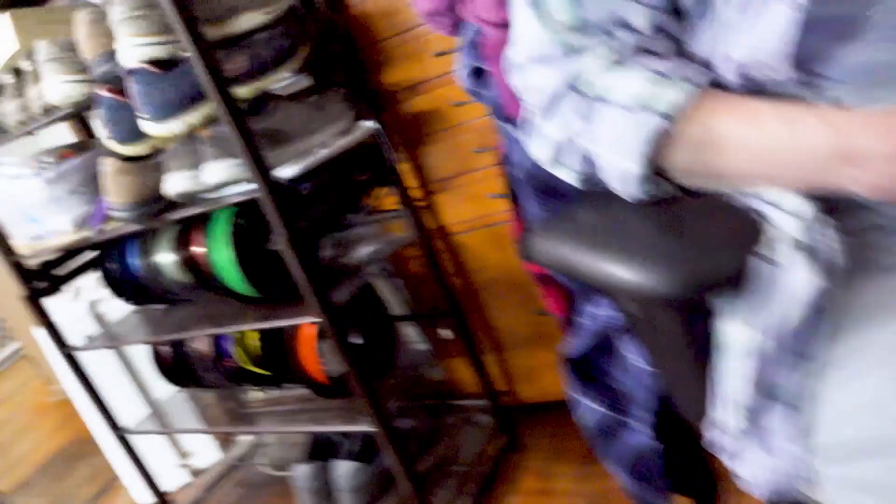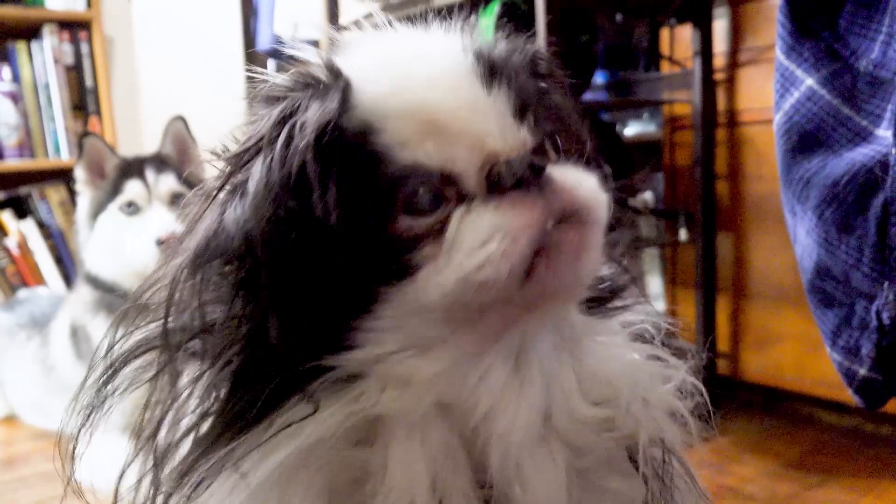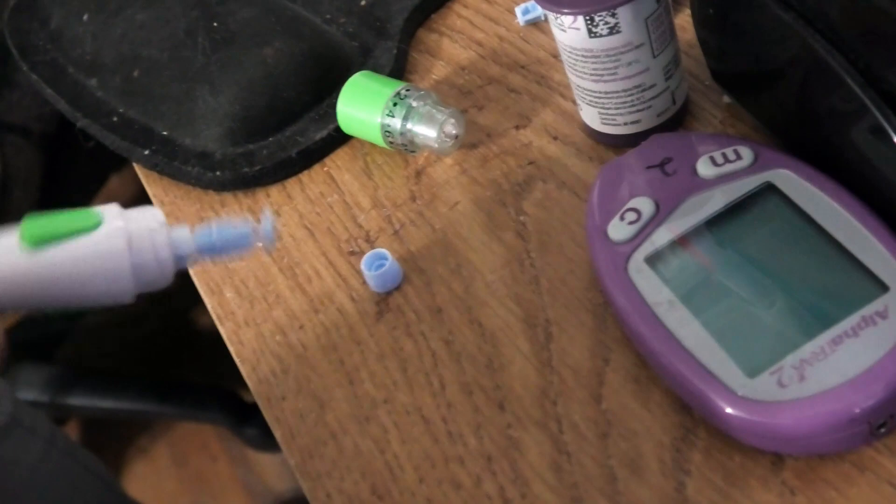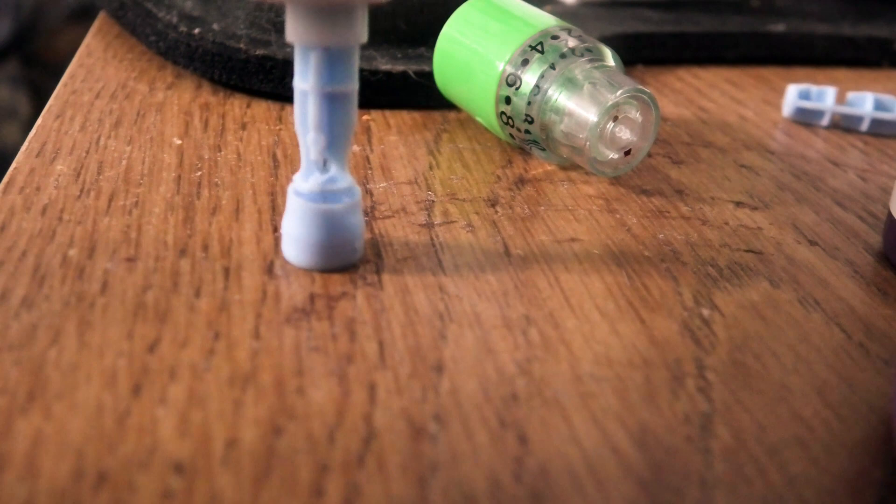How's Sammy doing? I'm doing okay. Are you okay, Sammy? He's fine. To throw away the lancet, I saved the cap — I just stick the needle into the cap and throw it away so there's no risk of getting stuck by that needle.